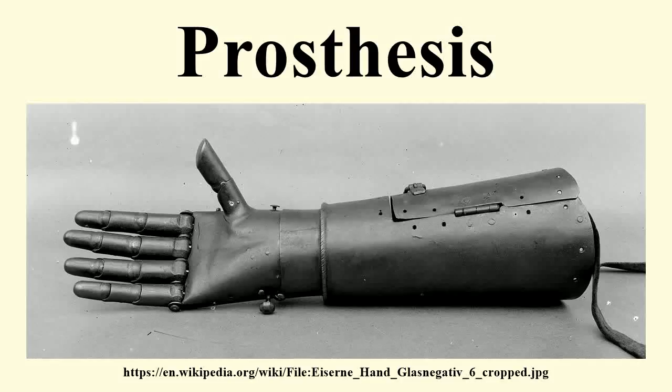In medicine, a prosthesis is an artificial device that replaces a missing body part, which may be lost through trauma, disease, or congenital conditions. Prosthetic amputee rehabilitation is primarily coordinated by a prosthetist and an interdisciplinary team of healthcare professionals including psychiatrists, surgeons, physical therapists, and occupational therapists.